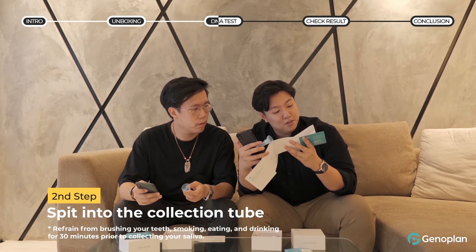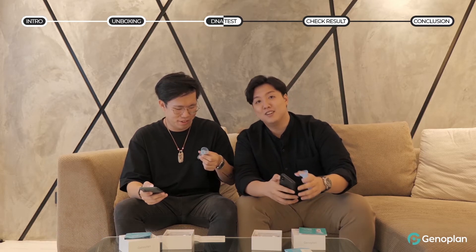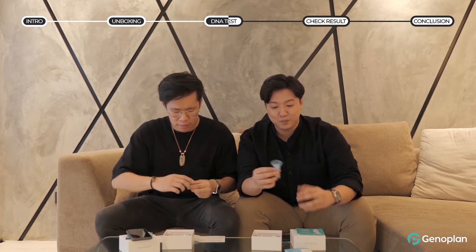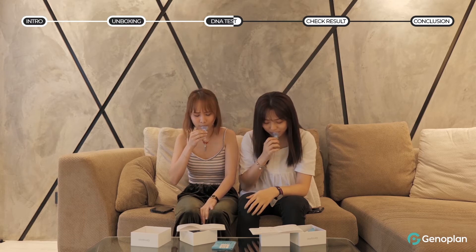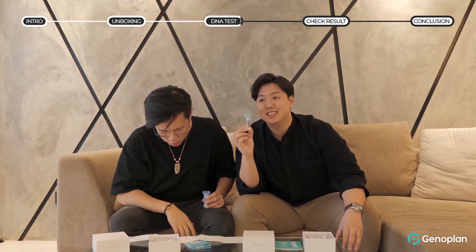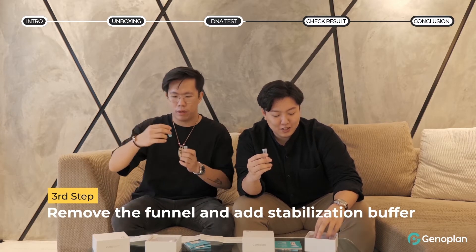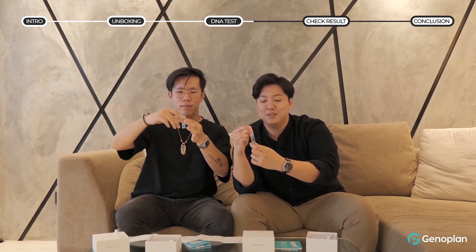The next step is to spit into the collection tube. You need to generate saliva and spit into it. It feels like a science experiment, doesn't it? It's very scientific.